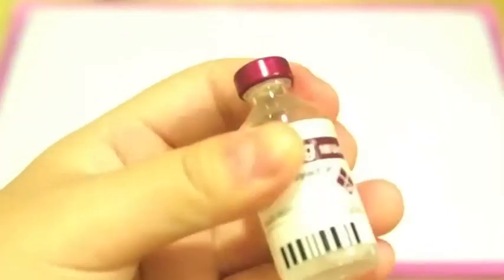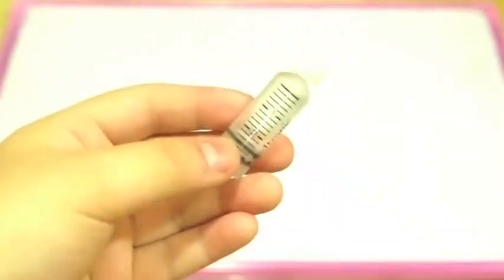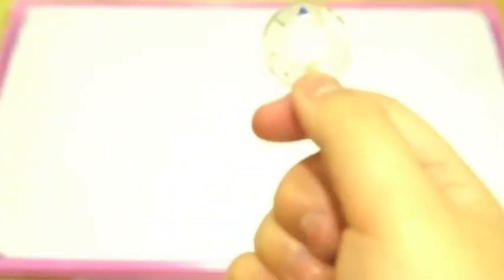This will be changed once every 3 days, and it can be placed anywhere with excess fat. The insulin will be delivered from the reservoir after pulling the insulin from a vial and placing it in the insulin compartment of the insulin pump, delivering the insulin through the tube and to the cannula.